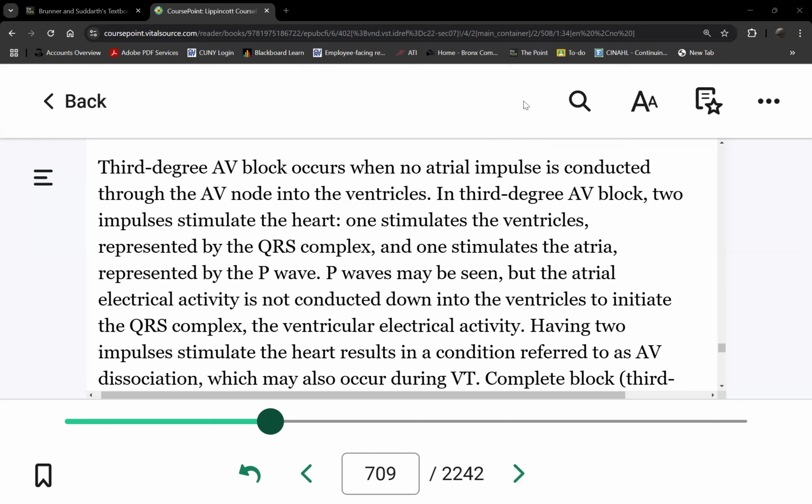Yeah, very uncomfortable. You're walking around attached to a big machine and it electrocutes you 60 to 100 times a minute. Is that comfortable? No. So if you need a long-term pacemaker, but you have an active infection, I cannot put a permanent pacemaker inside you yet, because what will happen to that pacemaker I implanted if you have a current infection in the blood? It'll get attacked. The organisms will attach to the pacemaker that I'm implanting.